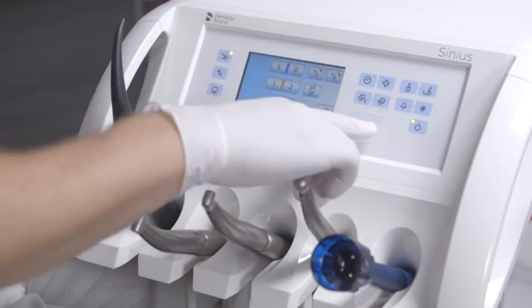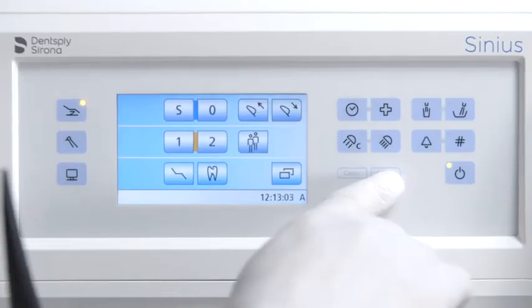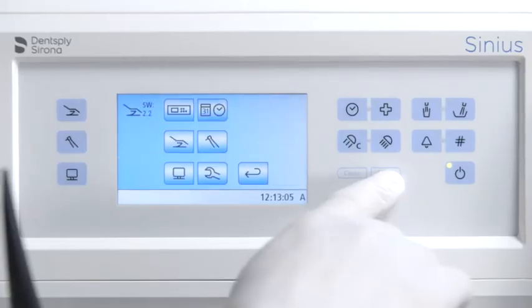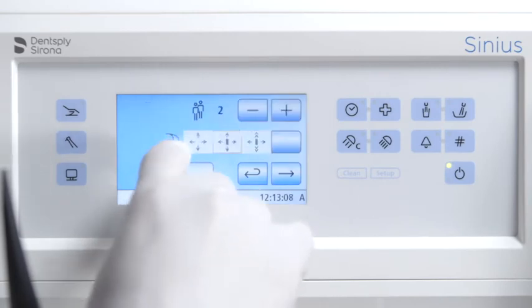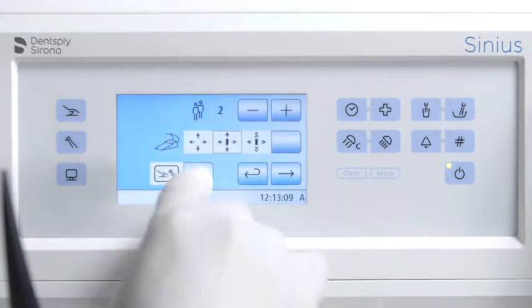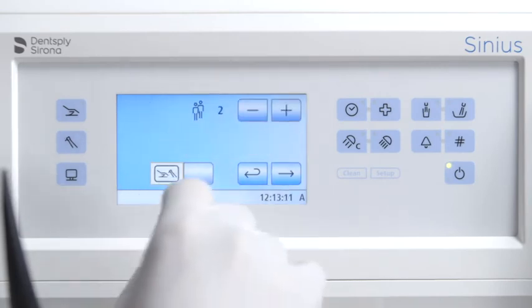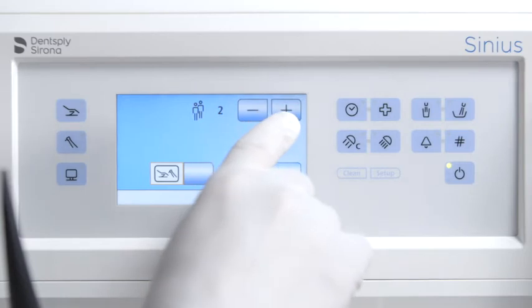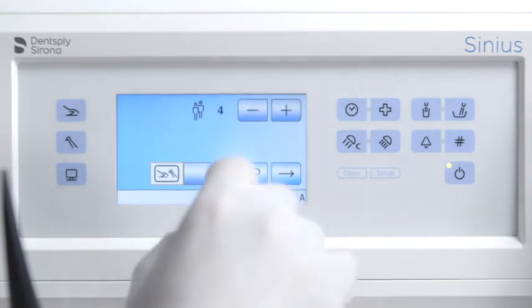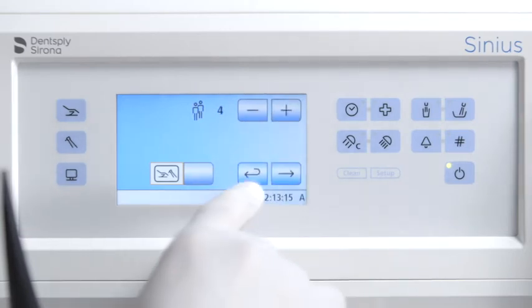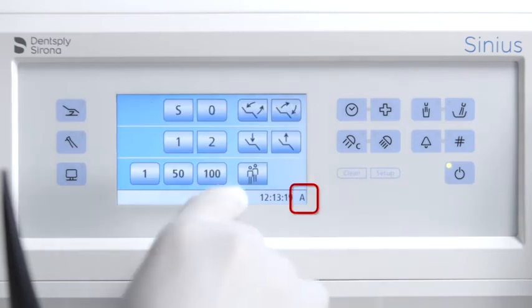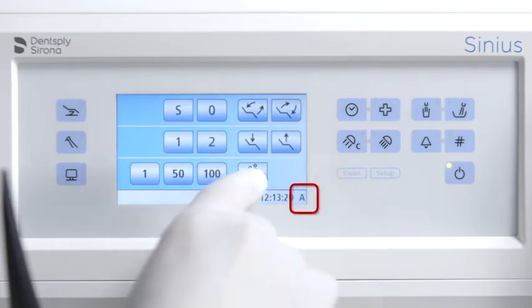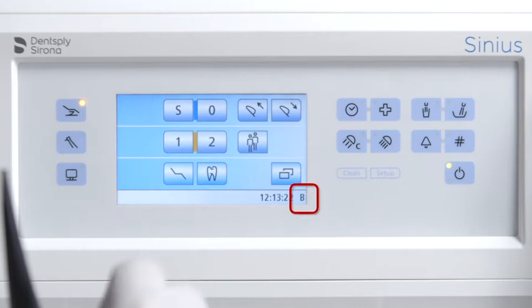Press and hold the setup button to select the start screen in the settings menu. A stored user profile can be selected for up to six different users, A to F. Each dentist can use a different start screen. The operator can be changed via the user profile.